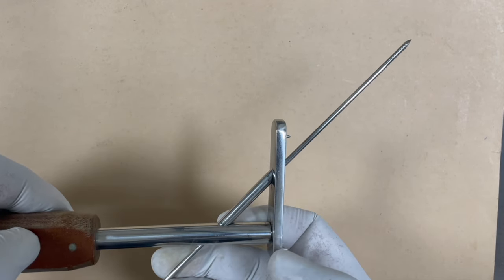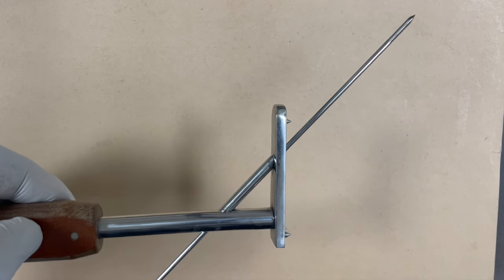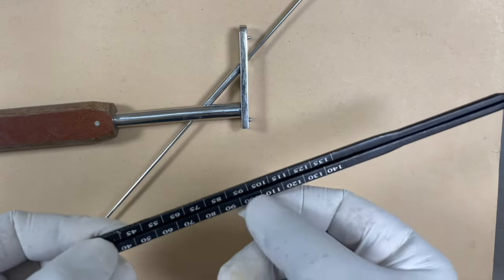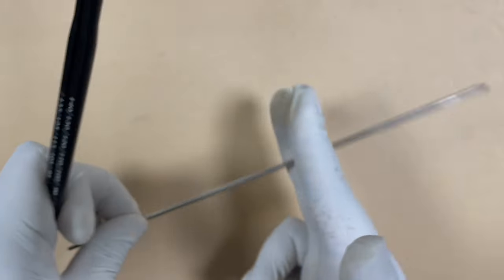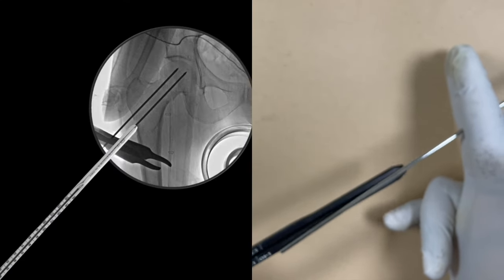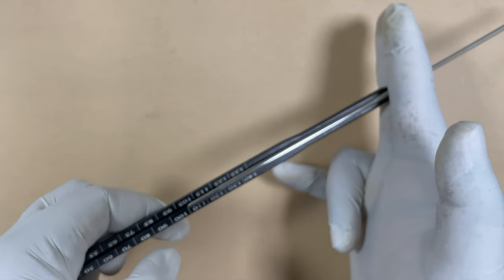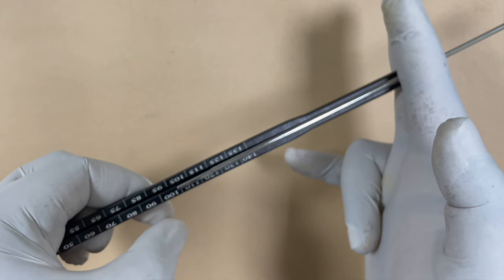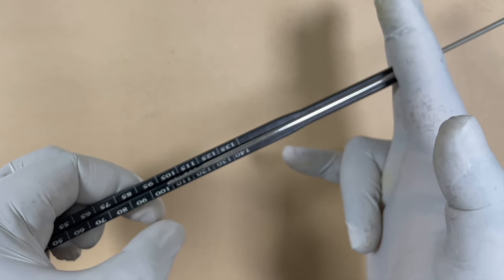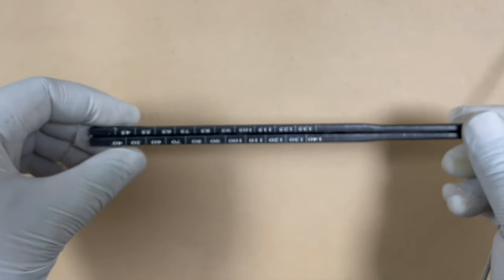Once you have passed the guide wire in the appropriate position, you have to use the direct measuring device. You see there are markings over here. Suppose the guide wire is ending over here on the lateral cortex — you pass this direct measuring device over the guide wire and it will show the marking. If it comes out to be 100, we have to use the lag screw of 100 millimeters. So this direct measuring device tells you the size of the lag screw.